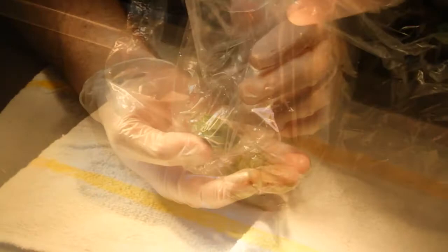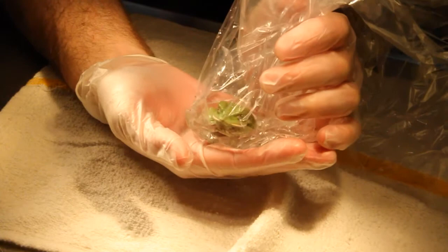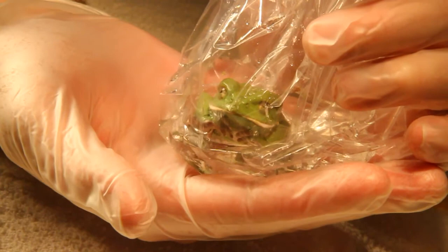The animal can be placed in a container or in a plastic bag for induction. The bag is preferred as it is less likely to cause injury when the animal goes through an excitement phase during induction. With either method, the animal must be monitored closely as they can drown if the nares are left under the water during induction.